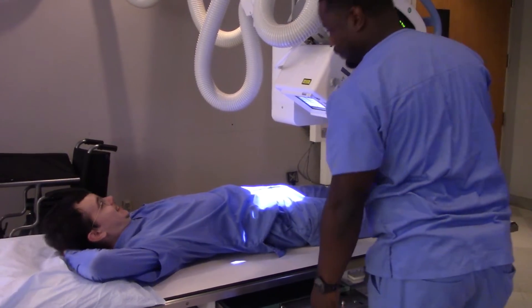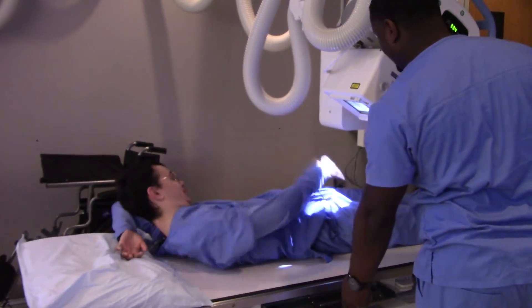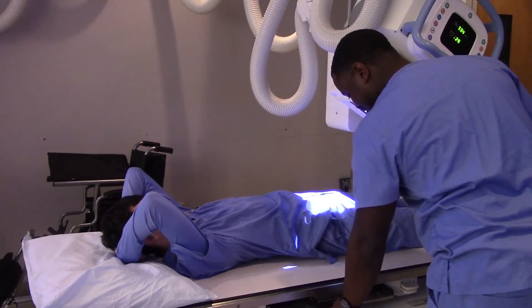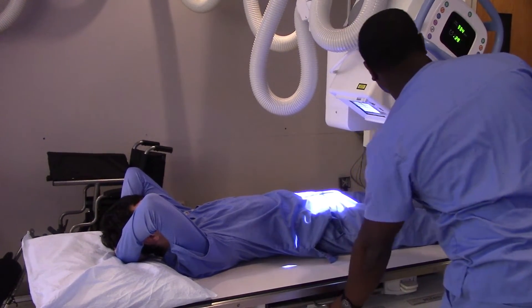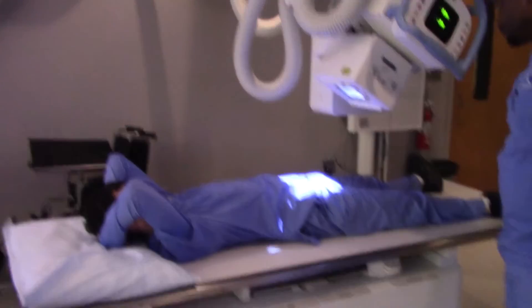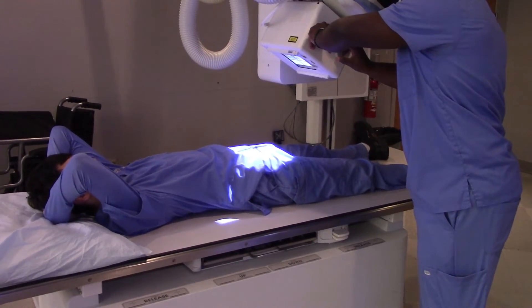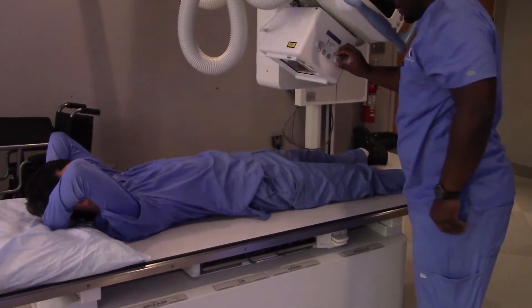Of course, you could always ask your patient, 'Sir, do you mind if I palpate your pubic symphysis?' He's not going to know what that is, so he's probably going to be cool with it. If we find the greater trochanter, that's going to put us at about the right level. And we're back at the mid-sagittal plane again, because we want to be dead center to the patient.